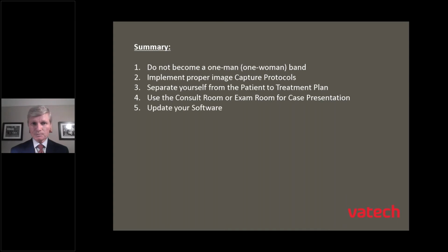Okay? And update your software. Very important to do that. Typically every 6 months is ideal. And education, education, and again, education.